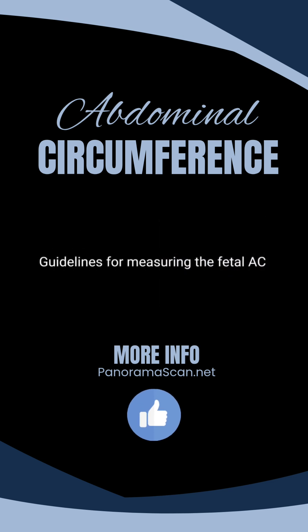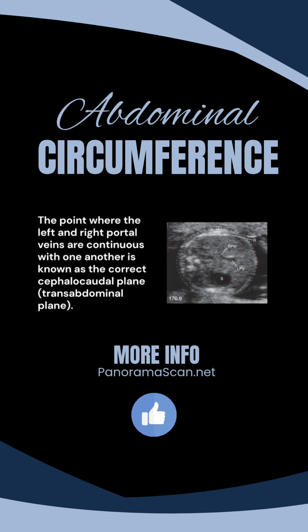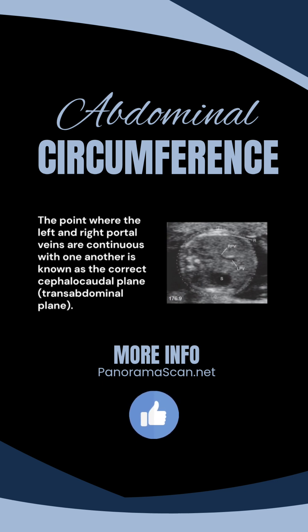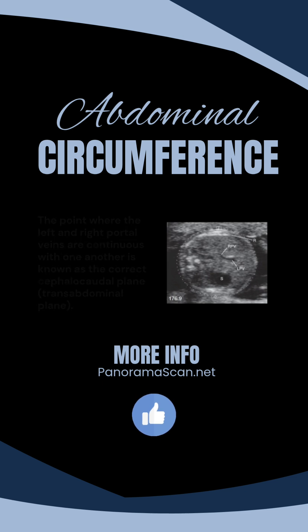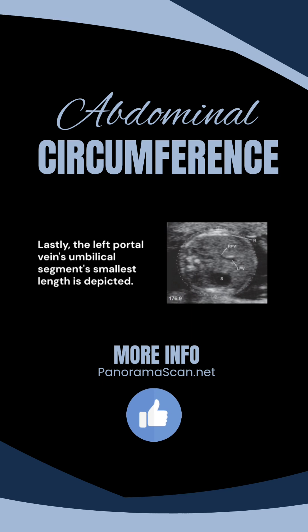Let's understand the guidelines for measuring the fetal abdominal circumference. The correct cephalocaudal plane, also known as the transabdominal plane, is the point where the left and right portal veins are continuous with one another. Second, the lower ribs have a symmetrical orientation. Lastly, the smallest length of the left portal vein's umbilical segment is depicted.